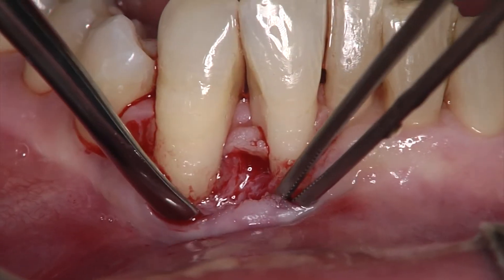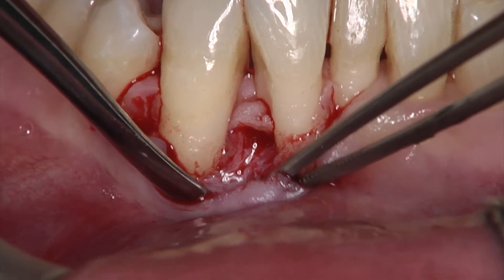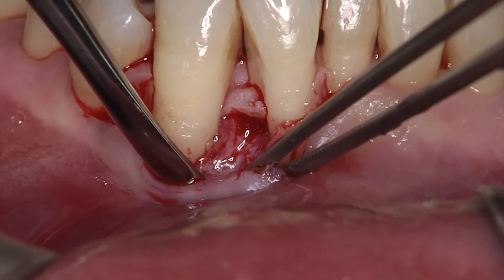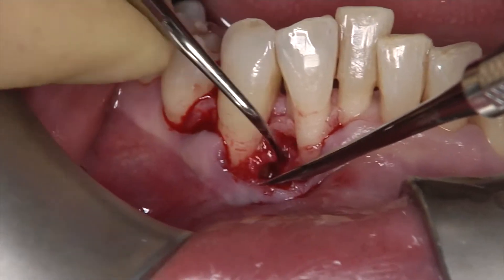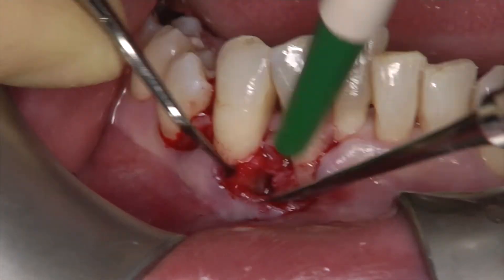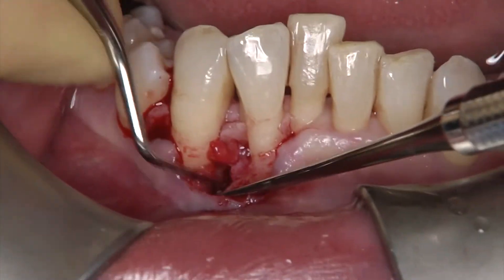Due to the buccal extension of the defect, a full thickness flap is raised on the buccal aspect only. This ensures proper surgical access to the root surface defect.